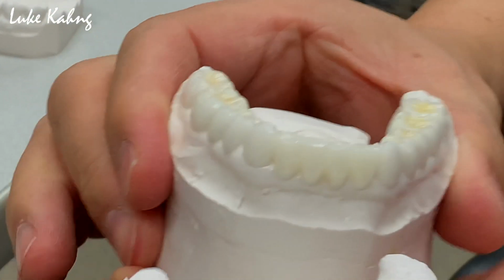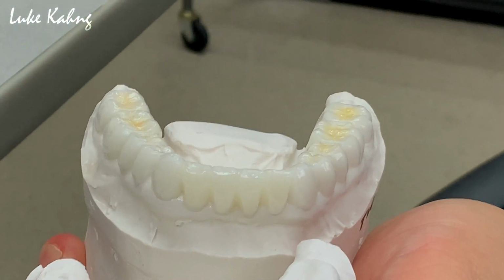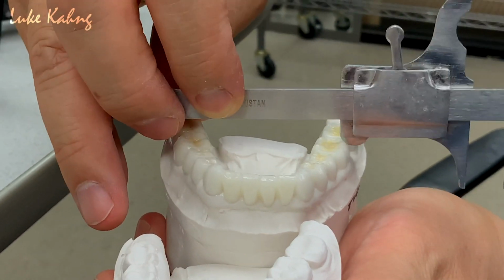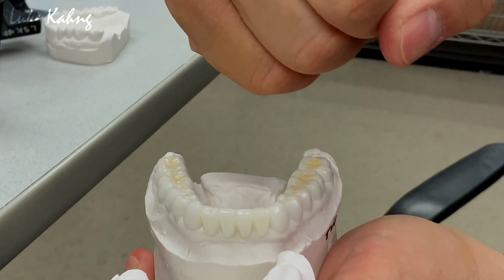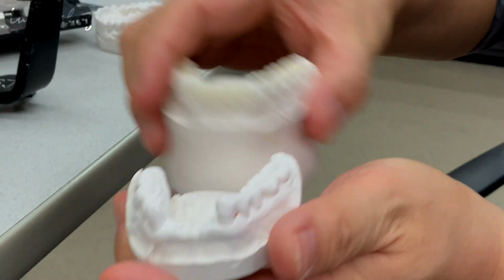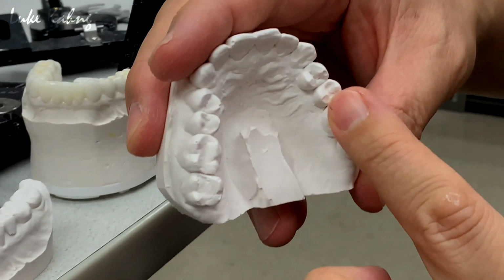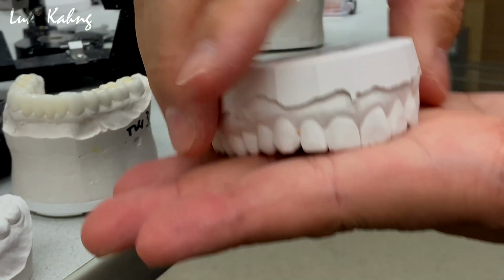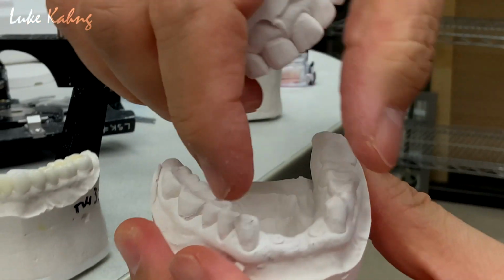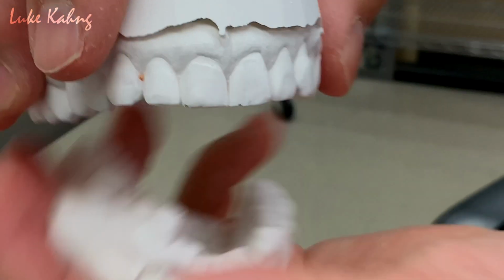But once you set up this, I want them to make it exactly the same as the other side, like this. Same level, same level, same level. It doesn't look like natural teeth, but I want to get the cusps touching the upper. So whenever you evaluate the teeth, here is more down, here's more up. Therefore we have to increase the vertical dimension, and then we have to reset. So number one, we have to do 22 to 27 first, and then we finish the upper with this.